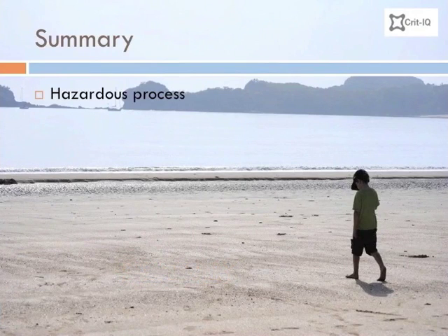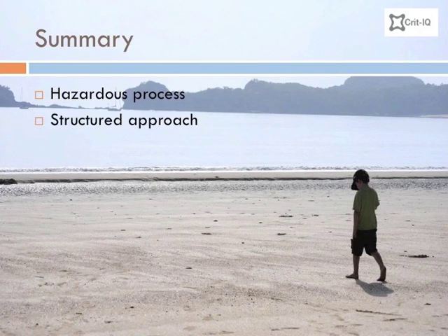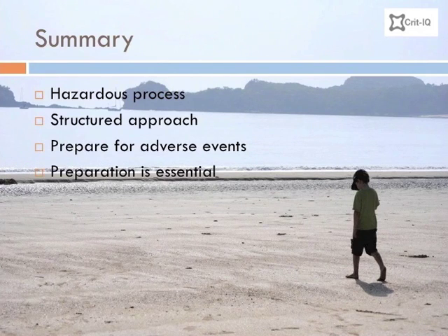Moving the ventilated patient is a hazardous task. To reduce the risk of misadventure, a structured approach is important. In this vodcast, we have reviewed the most common adverse events experienced during transport and stressed the importance of preparing adequately for them. We have reviewed the preparation for transfer, including obtaining sufficient information about the patient to ensure that you can manage them safely, checking equipment thoroughly, and anticipating and planning for adverse events.